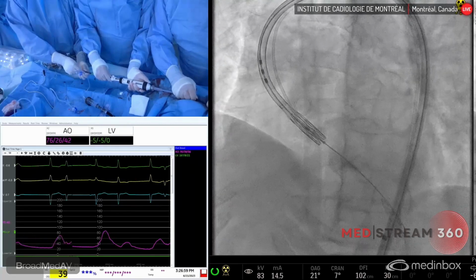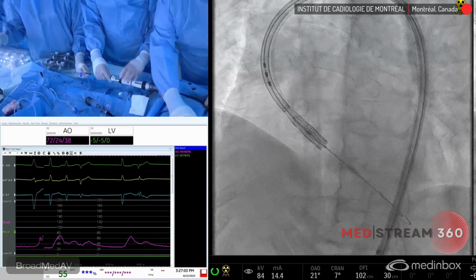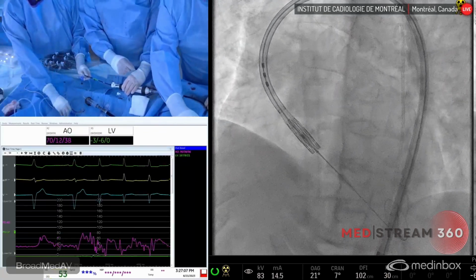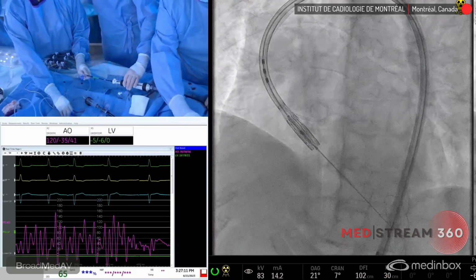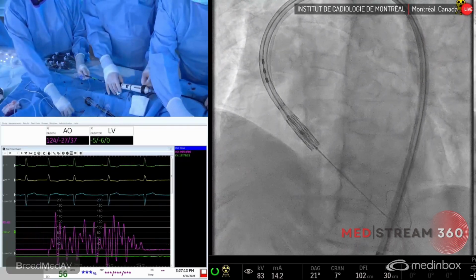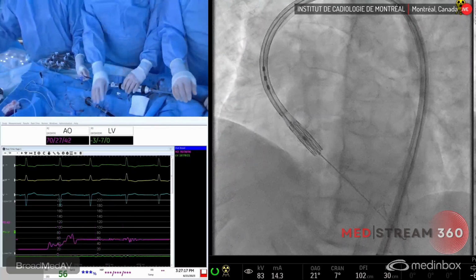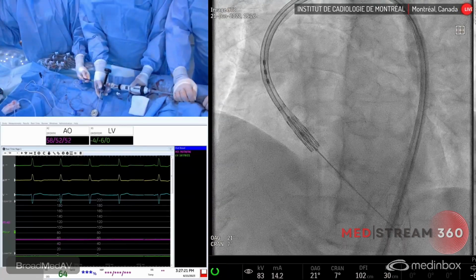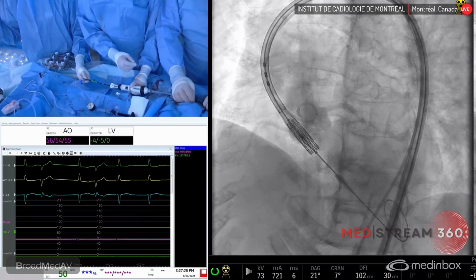Okay. Perfect. I think we'll bring it back. We'll do an angiogram here. Wait a minute. I will just bring it back. So we were aiming for 50-50, so we're going to do an angiogram here just to have a look. Okay, that's perfect, thank you. Okay, so Cine, when you're ready, I'm going to shoot. Okay, Cine. We'll take an image.